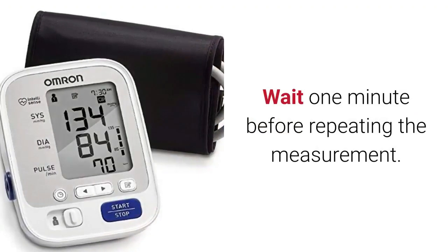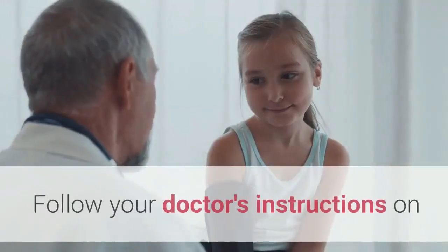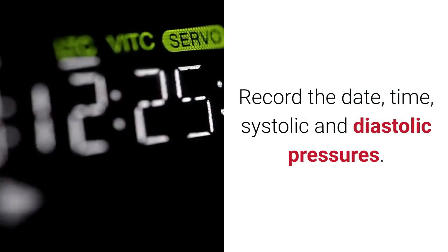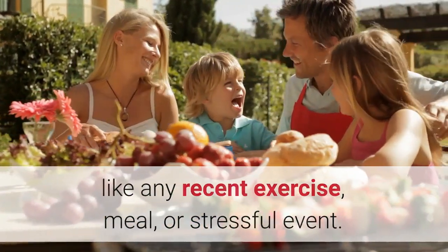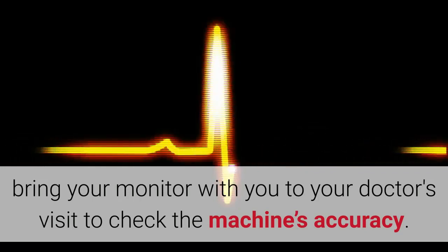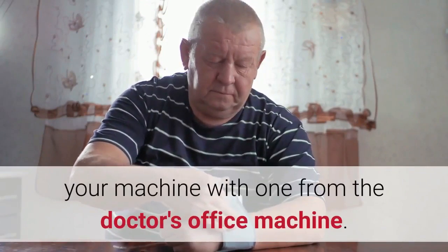Step four: record your blood pressure. Follow your doctor's instructions on when and how often you should measure your blood pressure. Record the date, time, systolic and diastolic pressures. You should also record any special circumstances like recent exercise, a meal, or a stressful event. At least once a year, and especially after you first purchase your monitor, bring it to your doctor's visit to check the machine's accuracy by comparing readings.